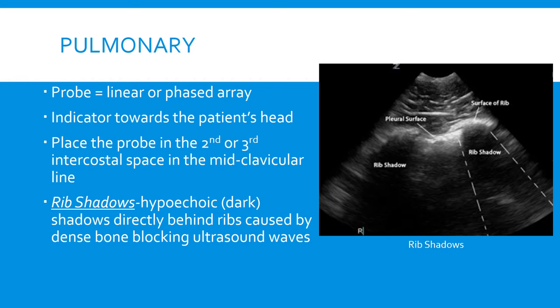For pulmonary we can either use the linear probe or the phased array probe. We're going to be pointing the indicator towards the patient's head and we're going to place the probe in the second or third intercostal space around the midclavicular line.